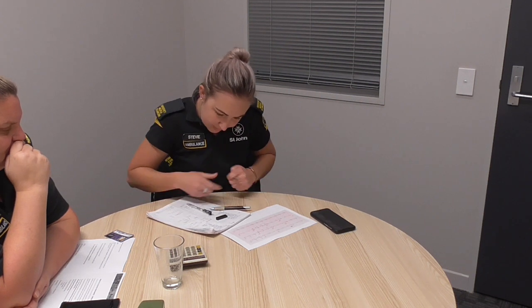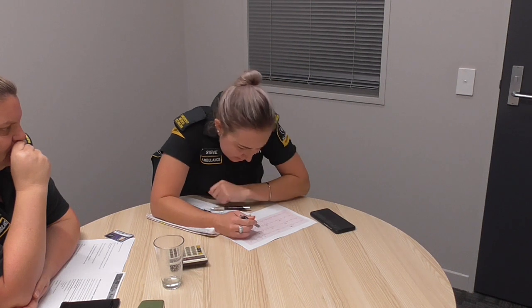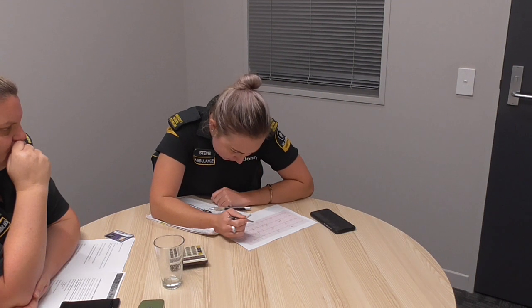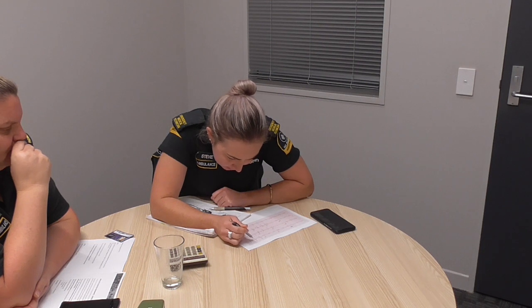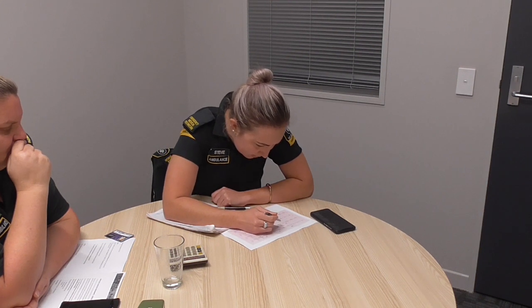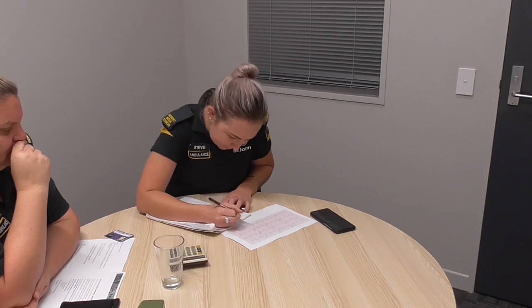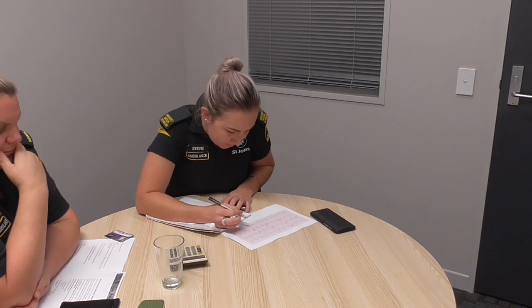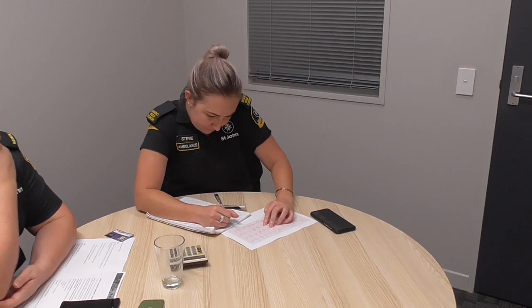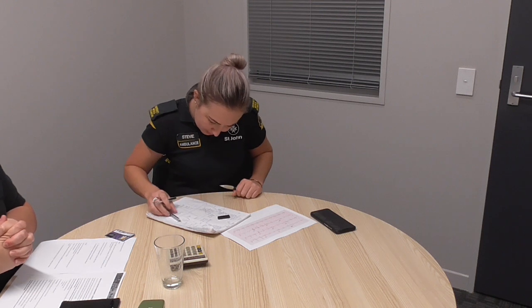ST segment, we've got elevation in V1, V2, V3, and depression in V4, aVR, and we can rule out the right bundle branch blocks.